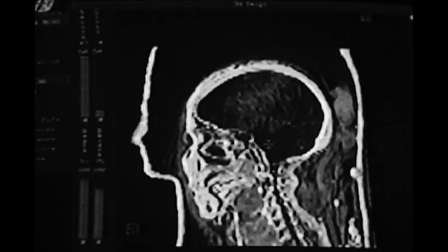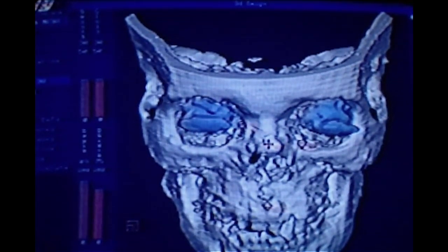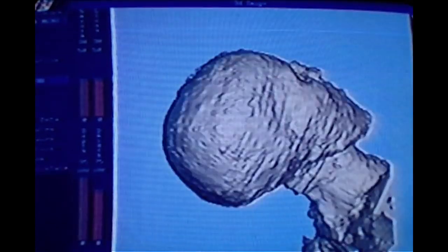Imaging the skull in a live patient takes 10 minutes. It took Holoka 3 hours to reconstruct Jed's skull and hundreds of hours to render the entire body. Holoka was then able to electronically peel away the layers. After removing the outermost layer of cartonnage, she arrived at the linen wrapping that surrounded the head. Gray circles showed up over the eye sockets. The Egyptians inserted plates behind the lids to keep the features from sinking. Holoka also noticed that in keeping with the ritual, Jed's brain had been removed and her skull stuffed with linen. Finally, the image of a small, young woman appeared.